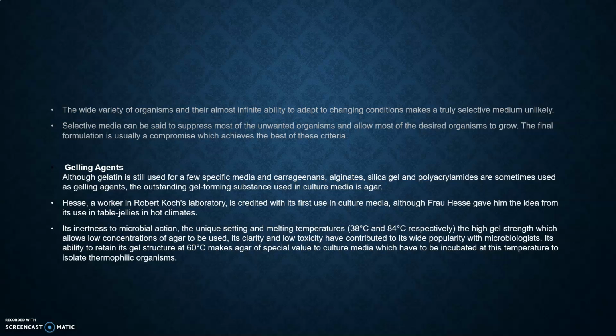Next addition of ingredient is gelling agents. Although gelatin is still used for specific media, and carrageenans, alginates, silica gel and polyacrylamides are sometimes used as gelling agents, the outstanding gel-forming substance used in the culture medium is agar.